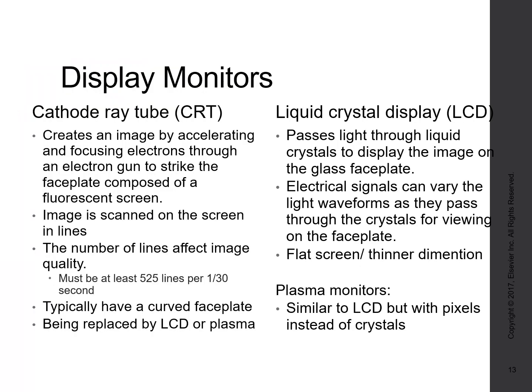Now, I'm not going to go too deep into our cathode ray tubes at this time because we're going to study them some in our fluoroscopy unit. But our cathode ray tube is, if you can remember maybe your grandma, or maybe your great grandma, probably had a TV that was about 4 feet wide and about 3 feet thick, and it maybe even sat inside of a big wood cabinet. Those were the old cathode ray tubes, and they functioned off of an analog signal.